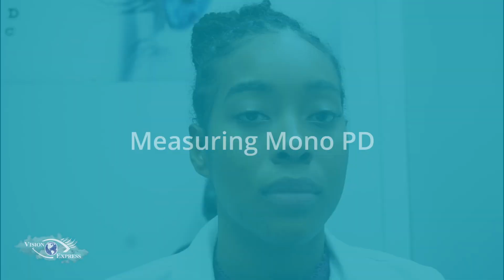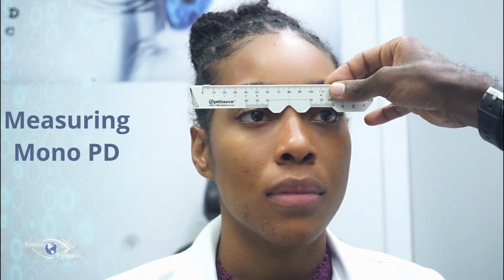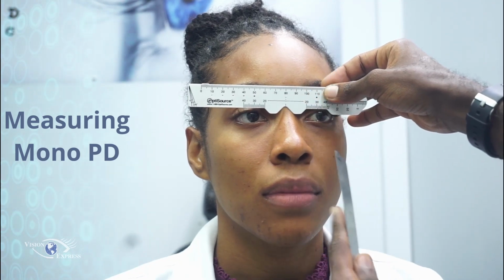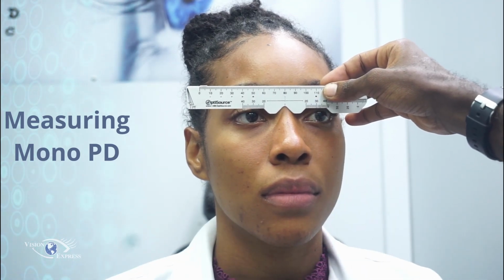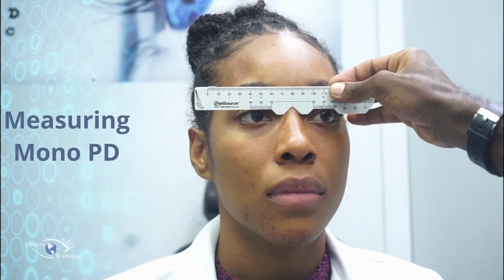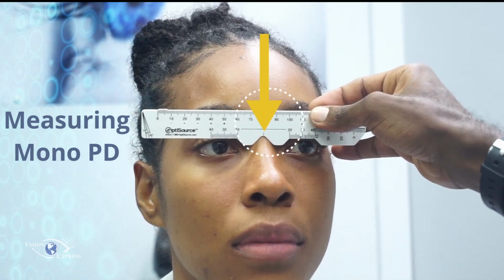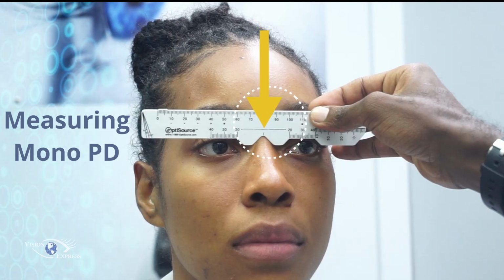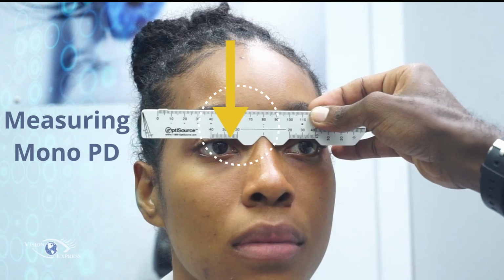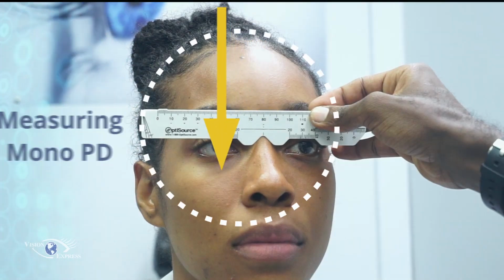Measuring mono PD. The mono PD is the distance between the nose bridge and either the right or left pupil. This measurement is important because in many instances, these measurements will be slightly different. Hold the curve of the ruler over the patient's nose bridge and measure the center of the pupil from the point of the bridge to the center of the patient's pupil.